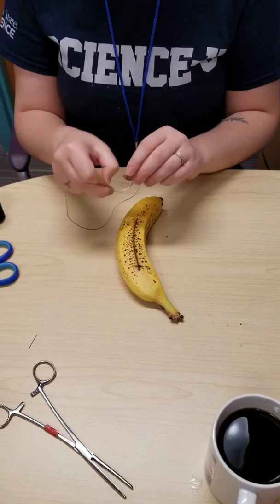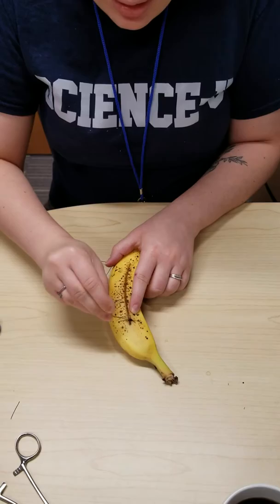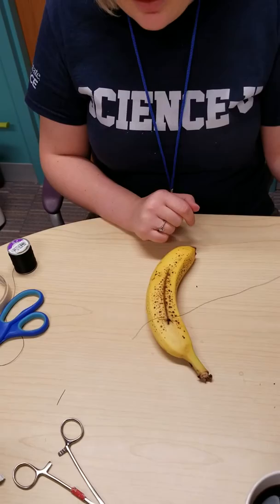On one side of our cut we're going to put our needle in, and then we're just going to curve it up and have it pop out the other side, then pull the needle through. Hold on to that loose end so the string doesn't fall out. Now we've got a short end on this side and a long end on this side, just like we did with the wooden board.